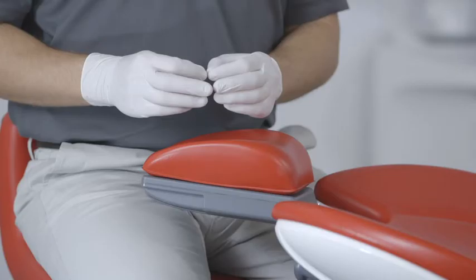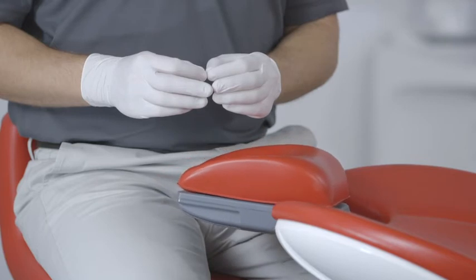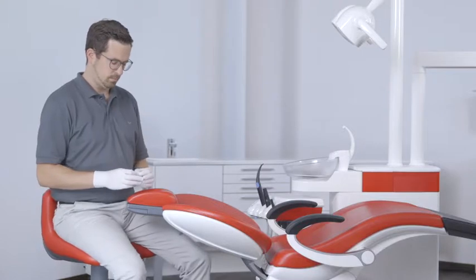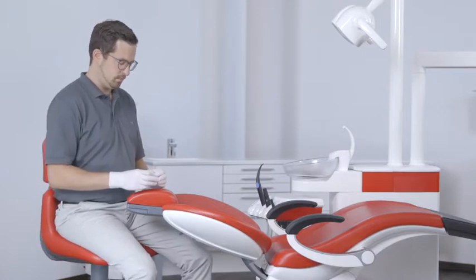Xenius knows your ideal working posture. To allow you to always work in the optimal position, it always places the mouth at the same working height, even for patients of different sizes.